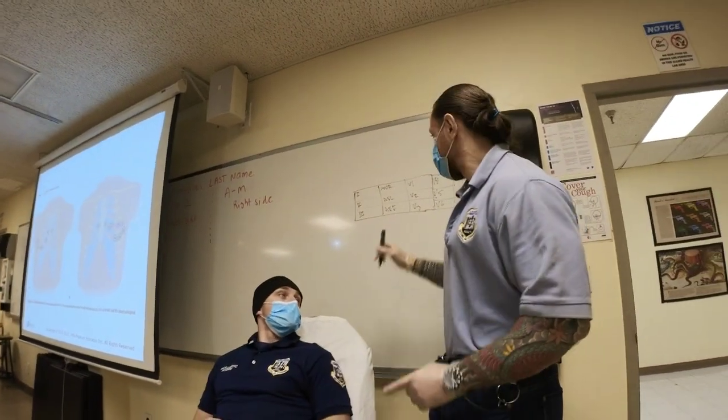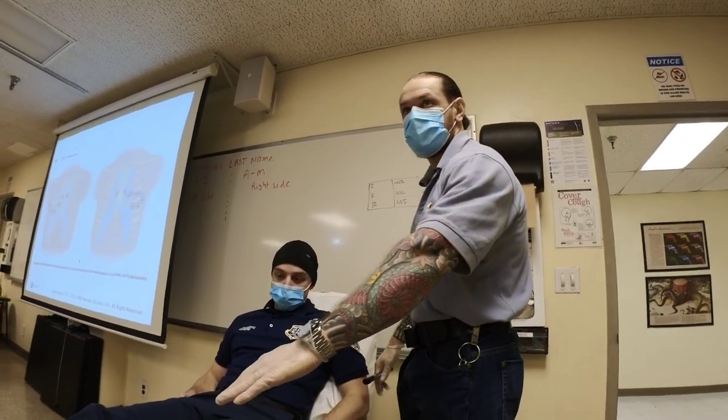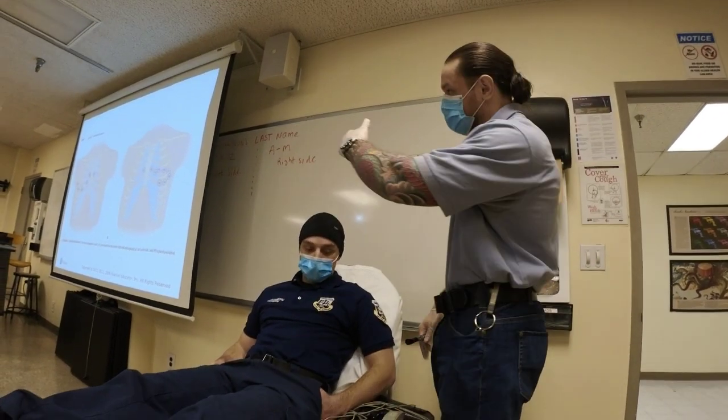So notice how they say augmented voltage: augmented voltage right, augmented voltage left, augmented voltage foot. That means the following. When you're doing a rhythm strip, a three lead strip, for example, I could put leads anywhere. I could put it on his torso, I could put it on his limbs. Doesn't matter. I'm getting my regular rhythm.